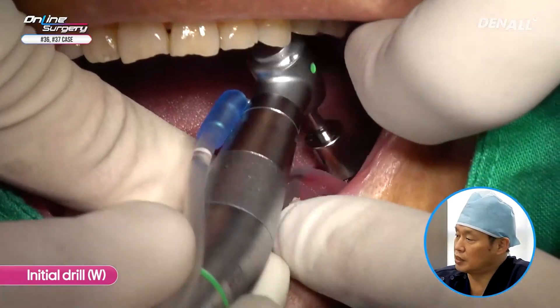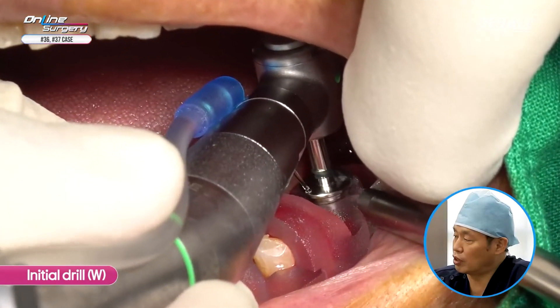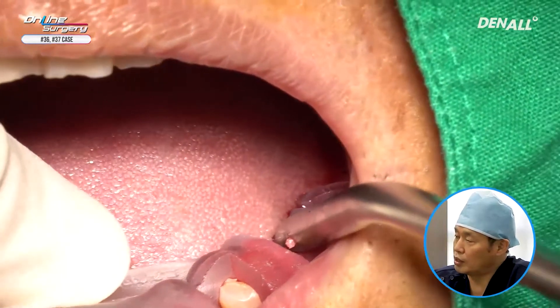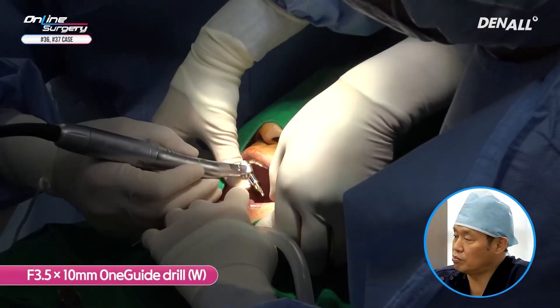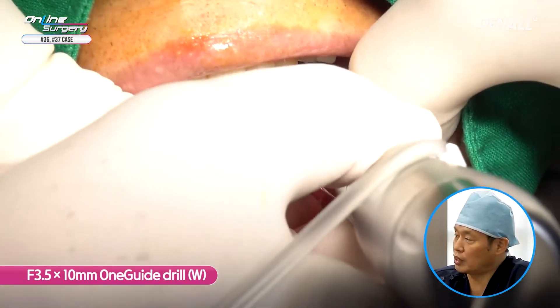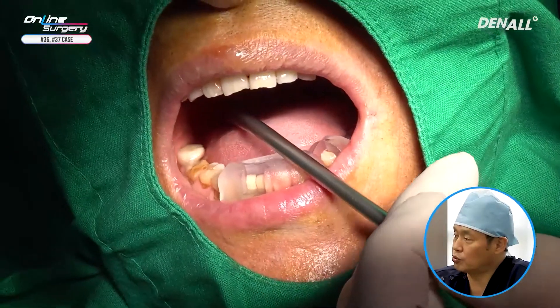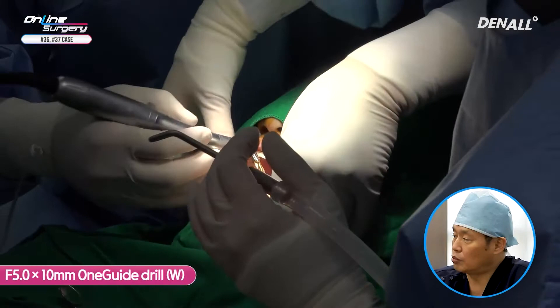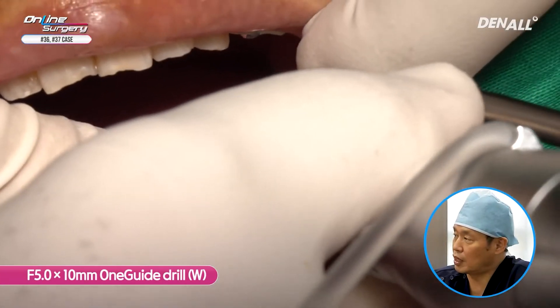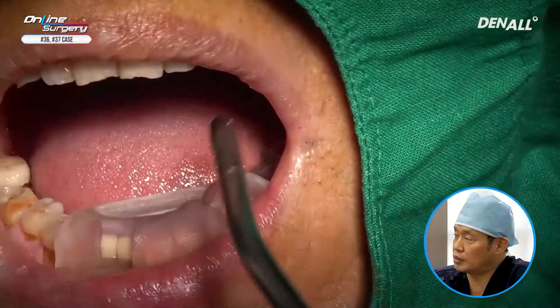I have now positioned the template. Using the guide hole, I check with my eyes whether the flap is slightly reflected, then drilling is done. The initial drill — one guide initial drill — is used and drilling is done in number 36. You need to check whether the drill goes in fully. Next, a 3.5 by 10 mm one guide drill is used for drilling. Because of the angle and the mesial teeth, you cannot really see, however drilling is done. Next, the 5.0 by 10 mm one guide drill is used for full-length drilling. Drilling is now complete.